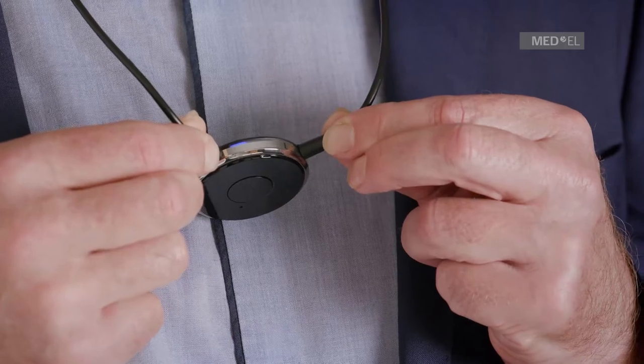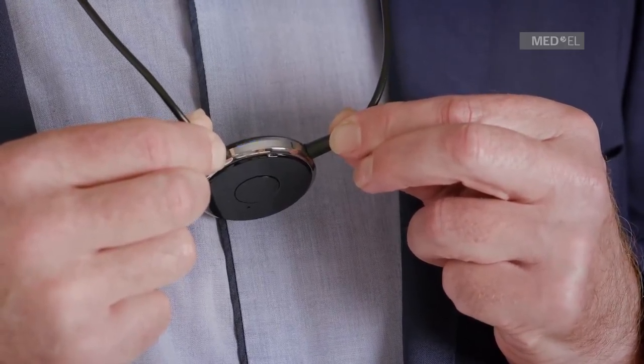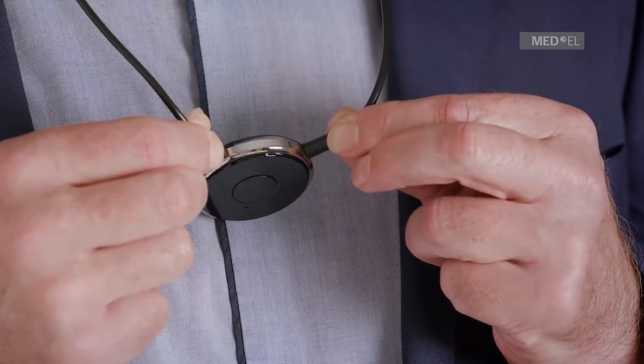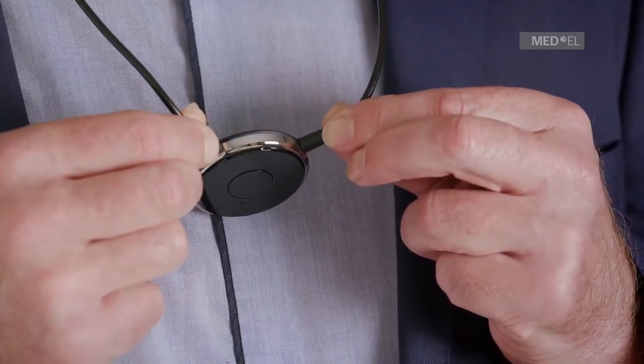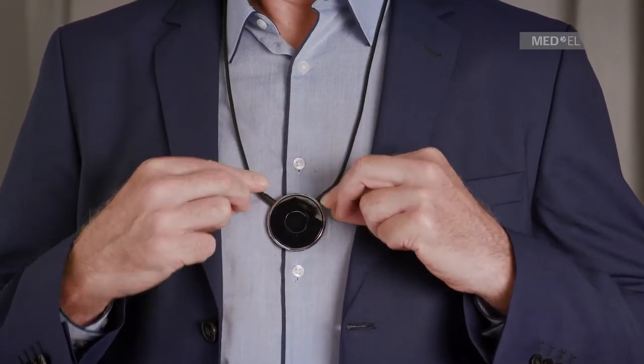If you are pairing Samba2Go for the first time, the blue LED may now flash to show Samba2Go is ready to be paired with a Bluetooth device. If you want to pair with a Bluetooth device, watch the video on pairing with a Bluetooth device.